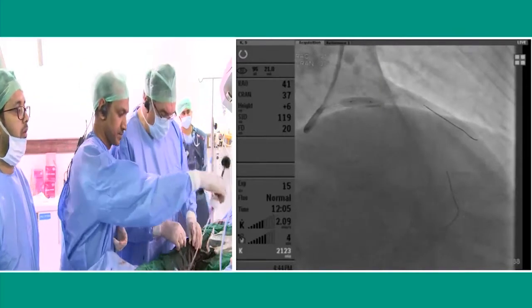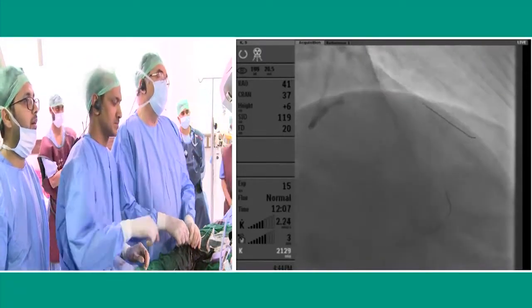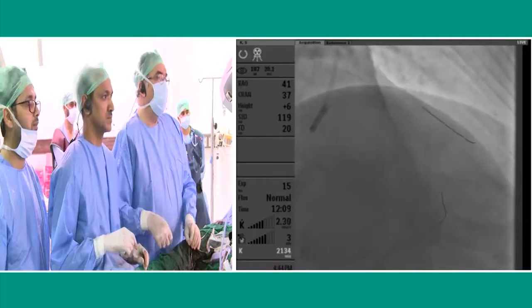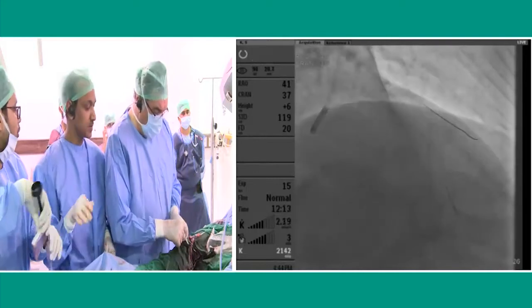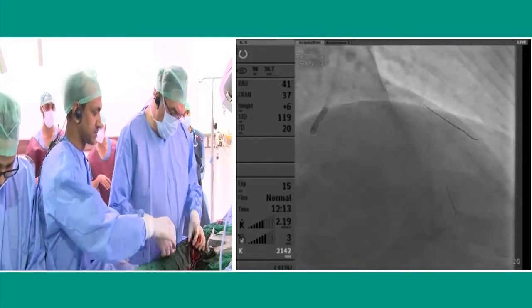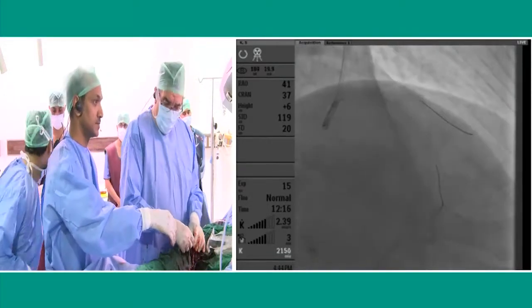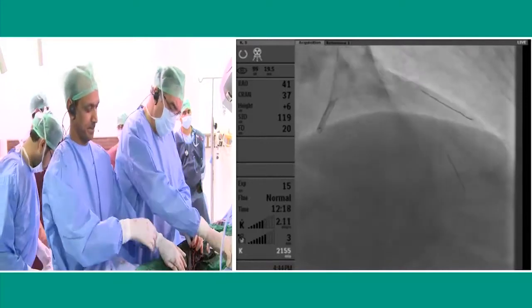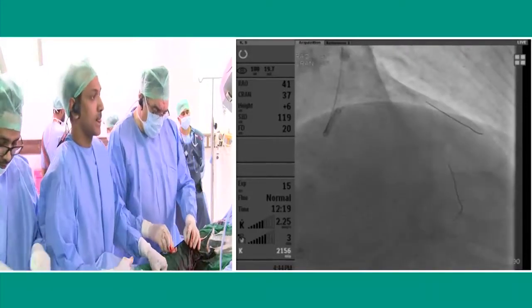So now what we could do is to take a view to have the result of that. And then with the third wire, we will... One more wire, please. Give me another BMW wire, please. Ready for the check? Okay, go on, check. Ready?